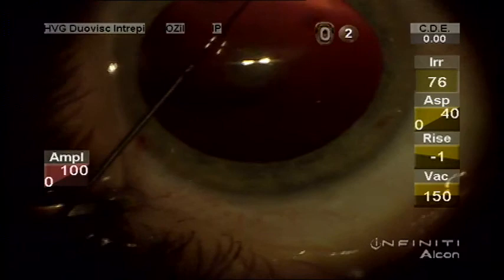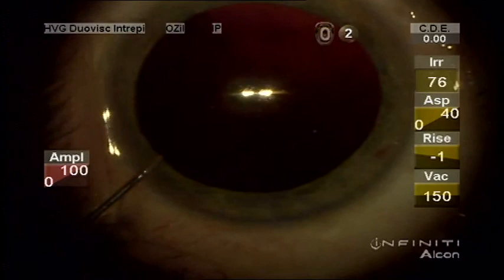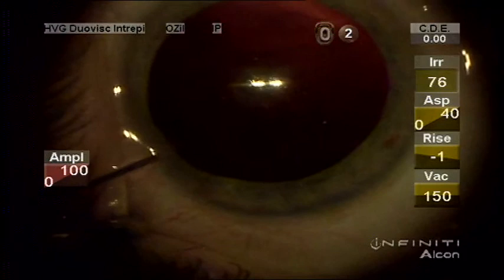Topical anesthetic applied by Dr. Gimbal, intracamerally, meaning into the eye, and to the surface of the cornea as well. Our patient's eye was anesthetized prior to the surgery. This solution is also in solution with the anesthetic is mydriatic, which will help keep the patient's pupil dilated.